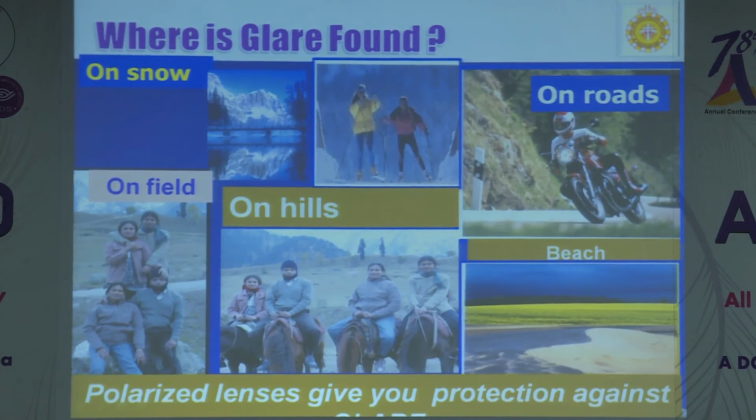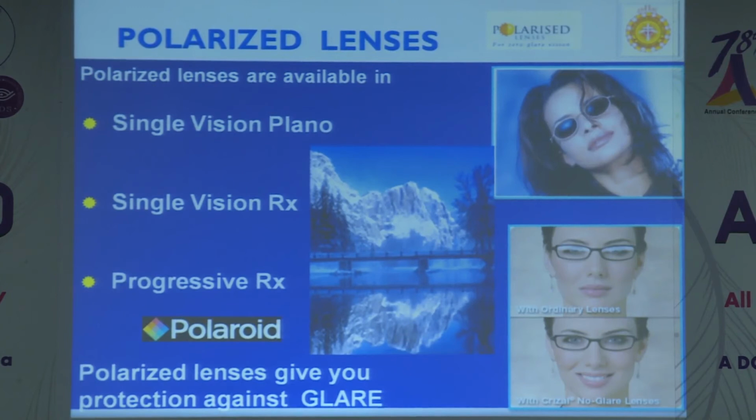So for protection, you should wear a polarized lens or Polaroid lens that is in the market. Plain Polaroid is available, or single vision glasses with power, or with progressive. Polarized lens is also available. That will give protection against glare and everything.